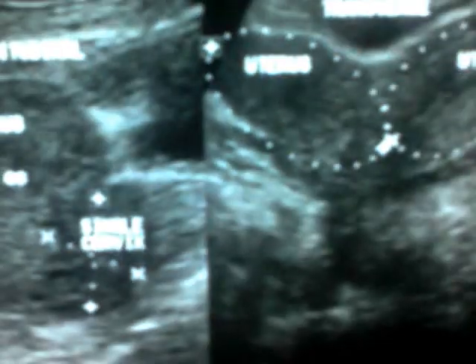Now this is again the same patient, but this is now the longitudinal view as well as the transverse view. In the transverse view you can see this is one horn, second, this is the endometrial canal, this is the endometrial canal, and you see an indentation in this region of the fundus of the uterus, where the endometrial canal becomes discontinuous.